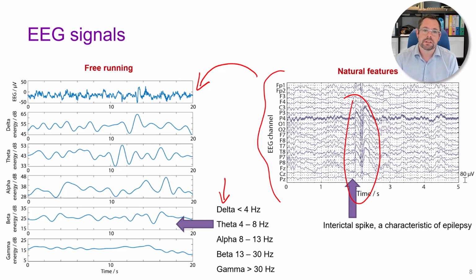And these can give characteristic patterns. So if you put electrodes towards the back of your head and you close your eyes, you will see more alpha activity. And so we can start to see responses that we expect. We can use that to check that we've set up the equipment correctly, but also start to infer what is the brain state of the user.